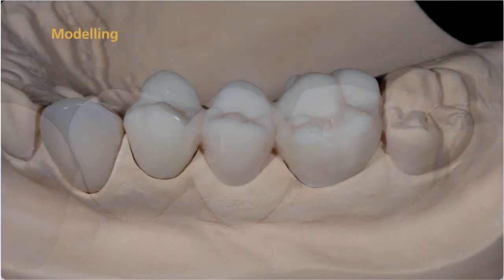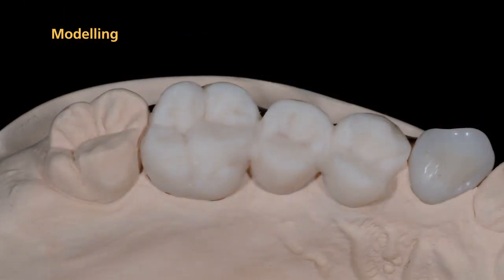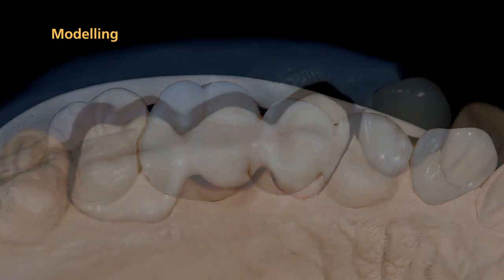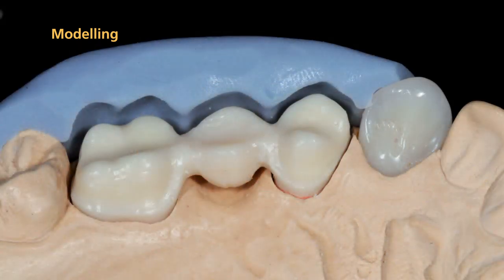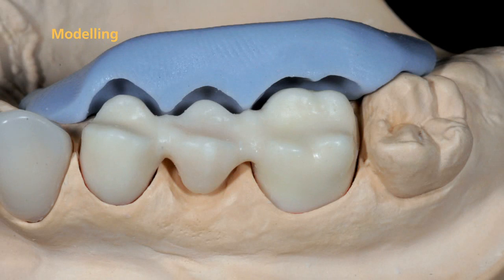It is recommended that you use a full wax-up. Create a wax-up that is fully contoured according to the anatomical tooth shape. Next, fabricate silicone keys of the anatomical tooth shape. You will use the silicone keys to check the space conditions during contouring. Subsequently, reduce the portions to be veneered and check them with the silicone keys.